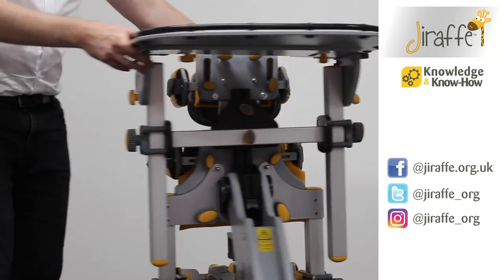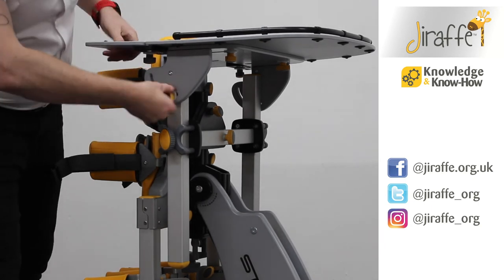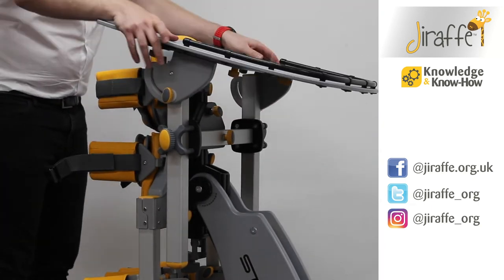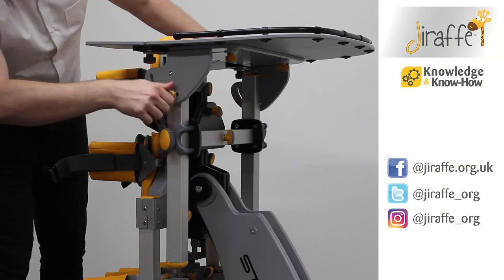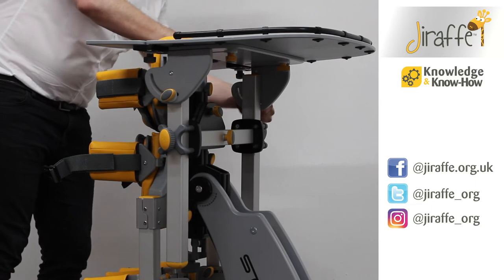We're also able to adjust the tray angle. If we loosen the wing knob on the side of the tray we're then able to angle the tray however we might need it. Once we've found the desired angle we can then tighten the wing knobs either side.